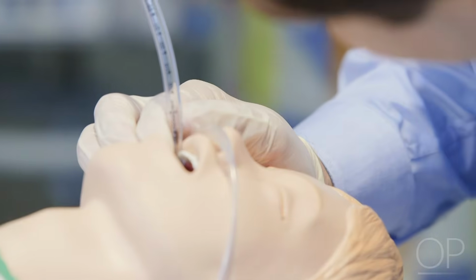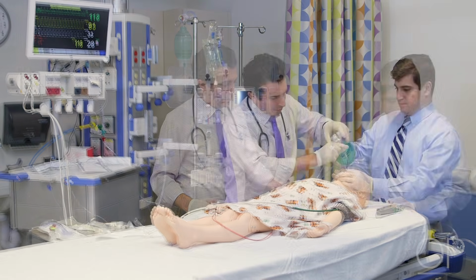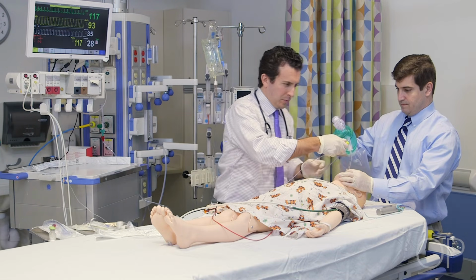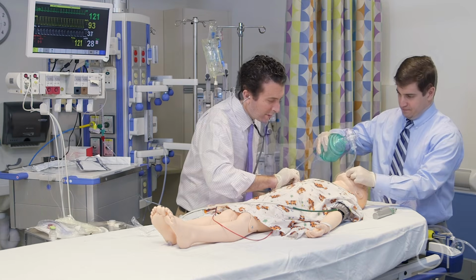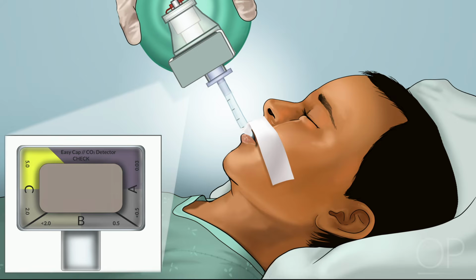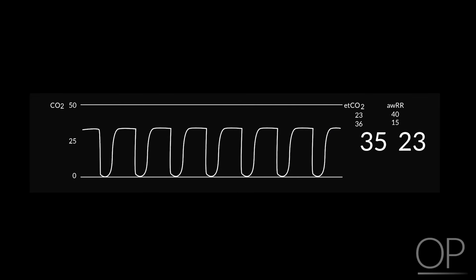The depth of the endotracheal tube at the upper teeth or gum should be reconfirmed, and to confirm correct endotracheal tube position within the trachea, the team should use primary and secondary indicators including equal breath sounds and chest rise, detection of CO2, either with color change when using a colorimetric CO2 detector or a detectable CO2 waveform when using capnography.